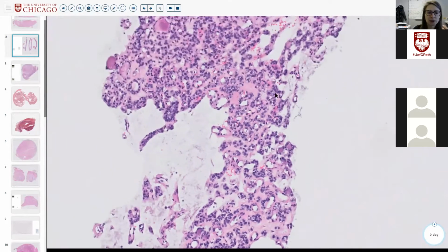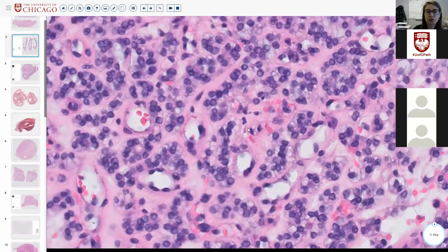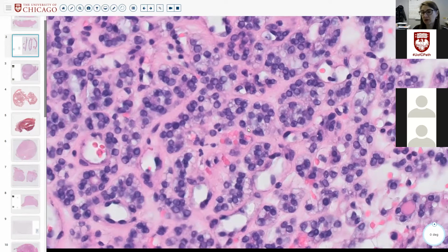So it's microfollicular. It's got super weird nuclei. But I don't know who of you was at my talk on Friday, the virtual path grand rounds thing, but your question of pseudo inclusions is a good one, right?